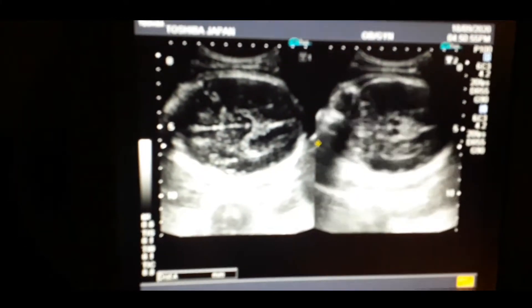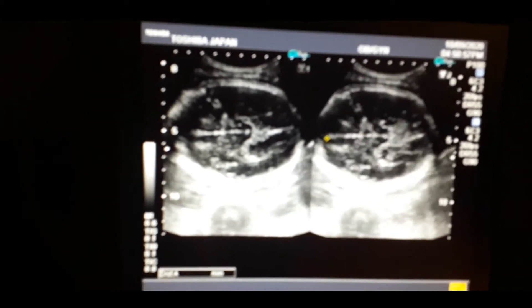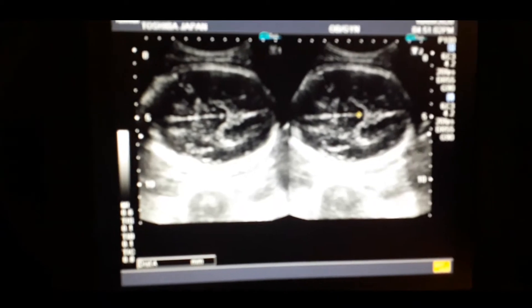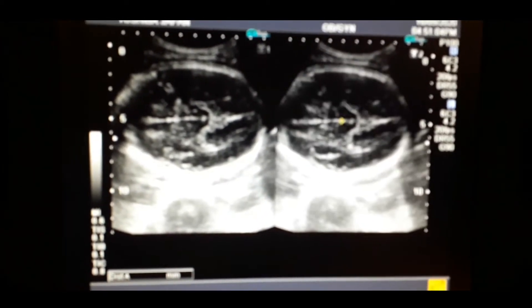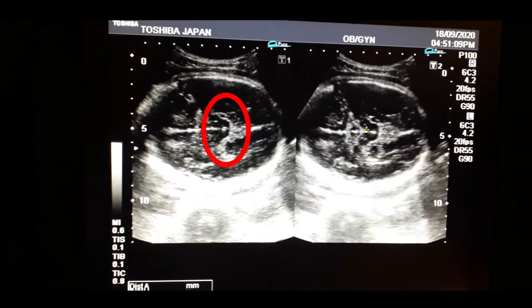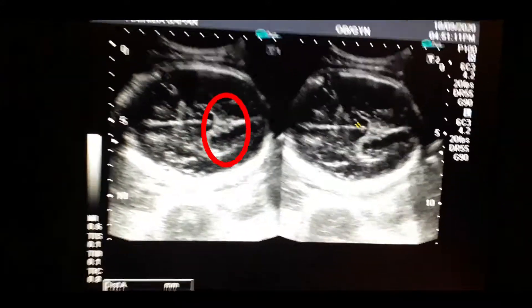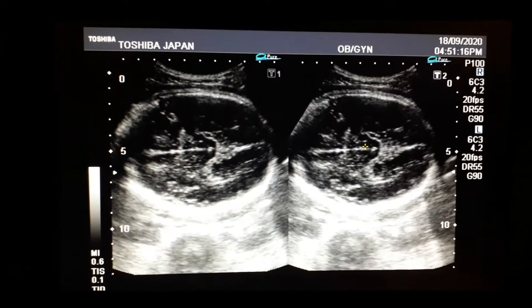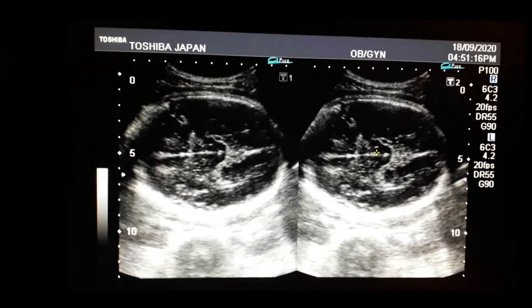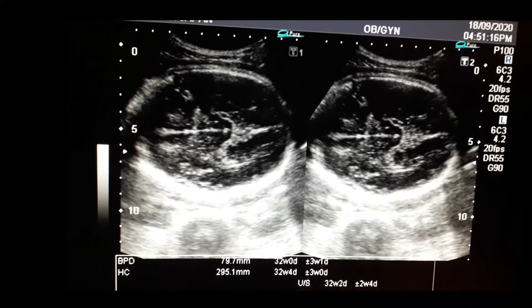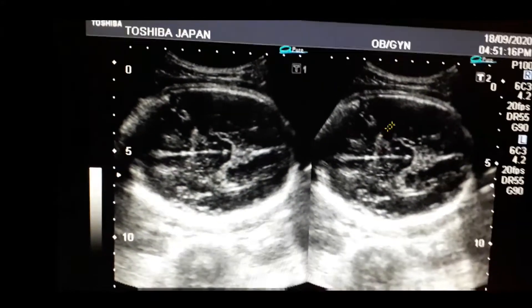Coming to the live case and taking the real-time section of the fetal head, you can see the thalamic plane — that is the triangular structure for the measurement of the biparietal diameter. You can see the arrow-shaped structure that is the thalamic plane. There is a midline echo and on both sides there is the thalamus.